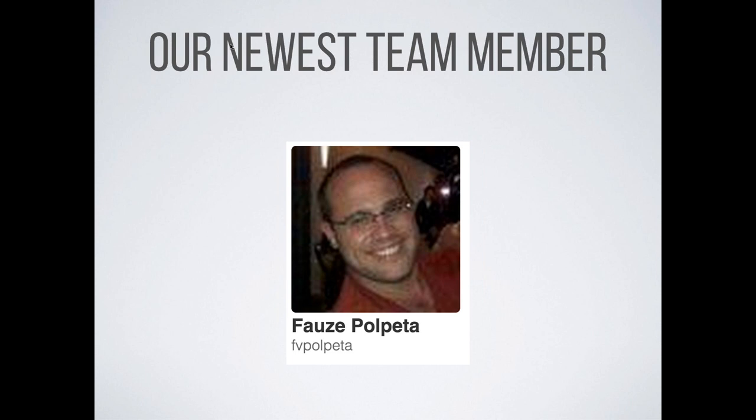We are up to version 1.0.4, and there are release notes alongside each of those versions that we've made available. 1.0.4 is the latest release. You should make sure that you're using the latest release of Horos. I think we probably addressed somewhere over a dozen bugs since the Horos application was released about 60 days ago.